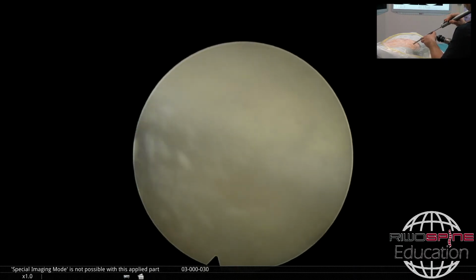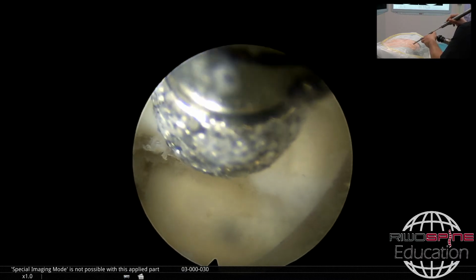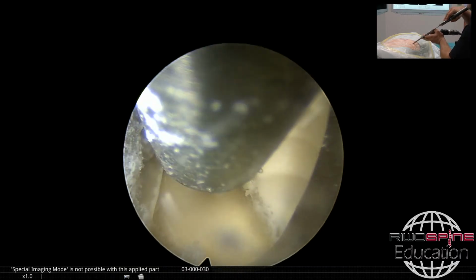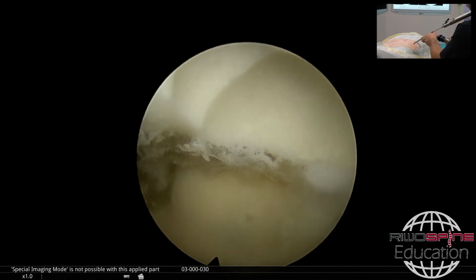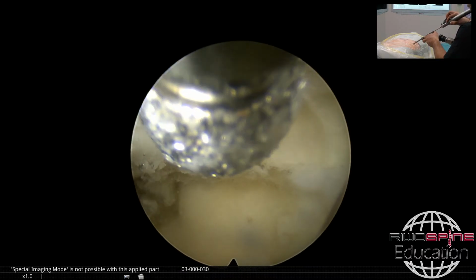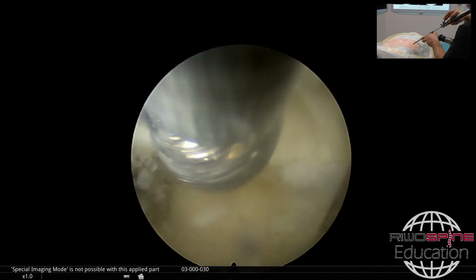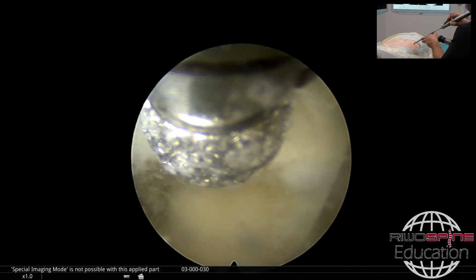This is very important because if you use straight shavers here, then to reach, for example, the caudal side, you need to change the direction every time. If you do this maneuver, every time you hit the ganglion here at that point, or you can squeeze the exiting nerve root easily. That's why this is a really big advantage of using a deflectable shaver. Without changing any direction of the sleeve and the system, you can keep the direction like that and easily reach the corners. This is the really, really big advantage.